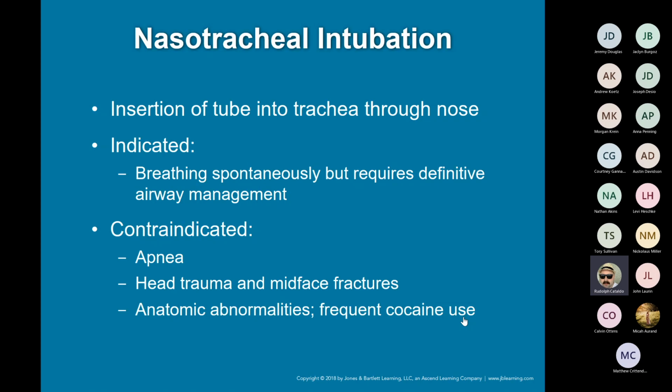Nasotracheal intubation isn't something we're going to use in the field a whole lot, if any, to be honest. A big reason is that the patient has to be able to breathe on their own. They might lack the capacity to manage their own airway. Now, it's totally blind insertion, just as it sounds. It goes through their nose. I don't want to say a shot in the dark, because it does work, but it's more of a clinical setting procedure.